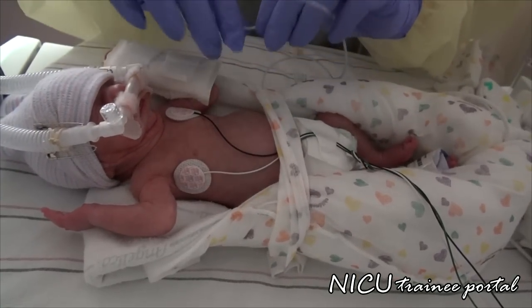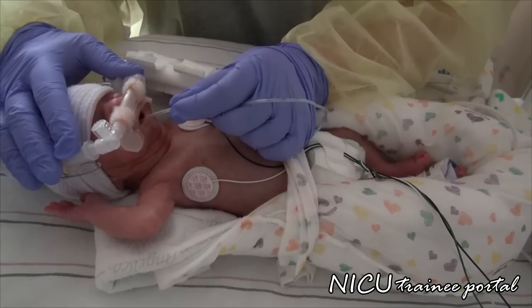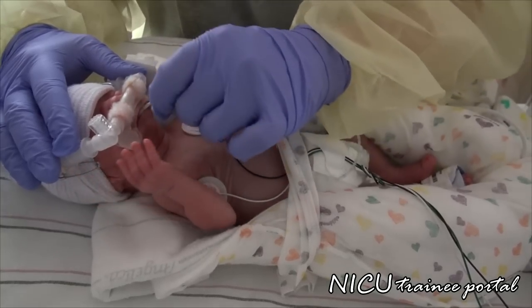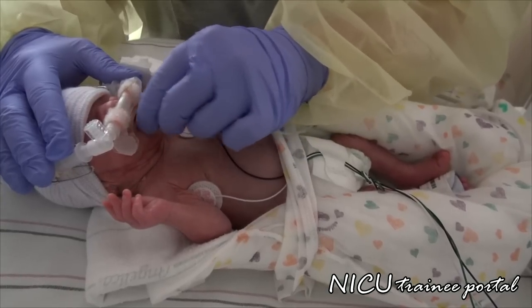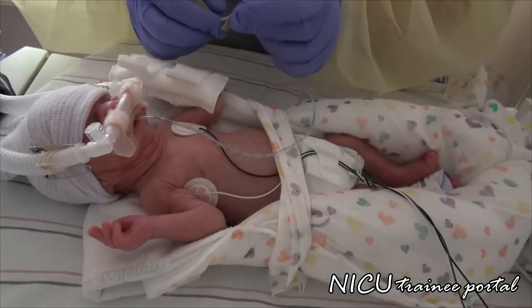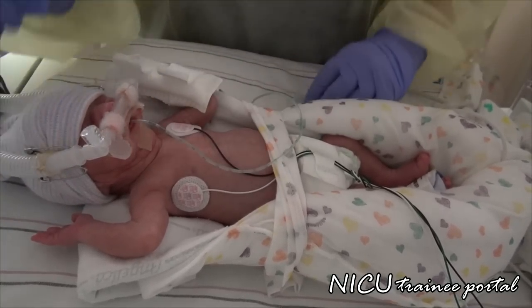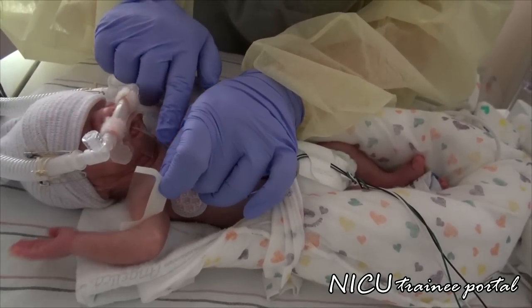When placing the tube, it's much easier if you wait for the infant to open their mouth a little rather than fighting them. Slide it in above the tongue, across the palate to the oropharynx — it should go down very easily into the oesophagus with no resistance. If you meet resistance, stop and start over. This tube is going down very easily and we are at 18 cm at the lip. Tubes can be secured in a variety of ways; we tend to use duoderm on the chin to protect the skin and tegaderm over top to secure it. Double check your measurement before applying tegaderm — we're at 18 at the lip.